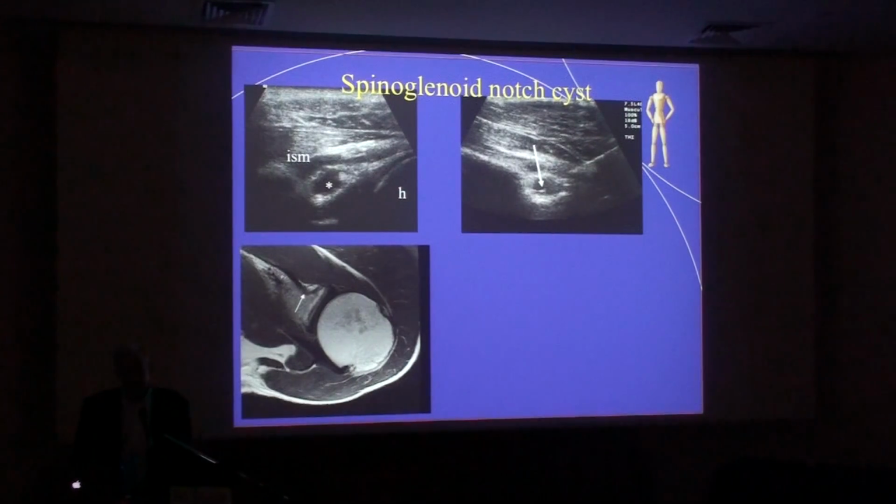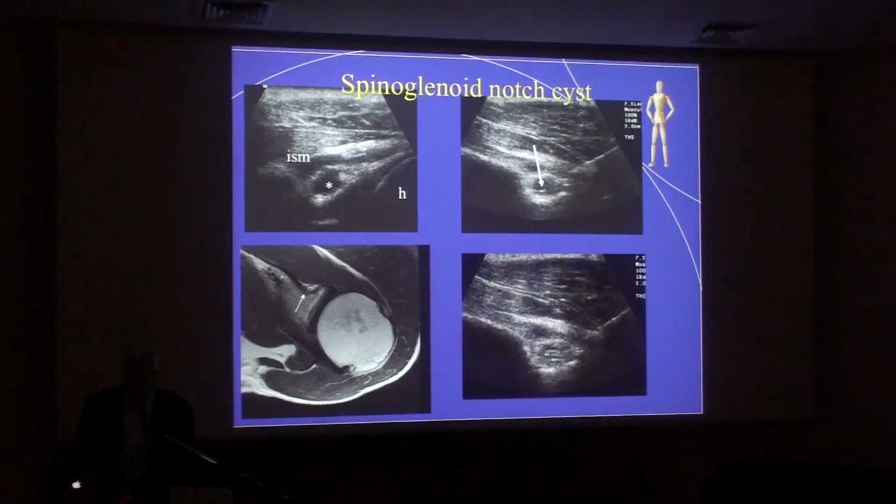And then I'm going to do a series of lavages and aspirations of that, and ultimately leave a little steroid mixture. You can see that the cyst is now filled with low-level echoes due to distension from the corticosteroid anesthetic mixture that I placed into it.